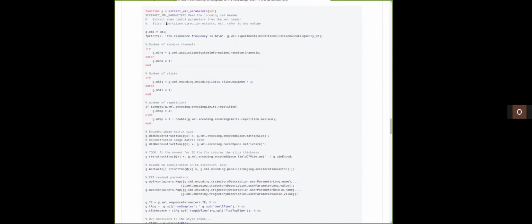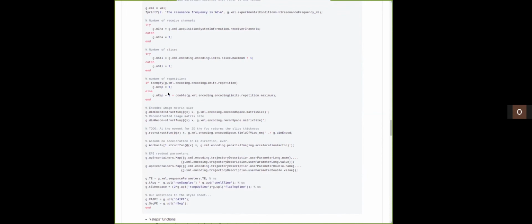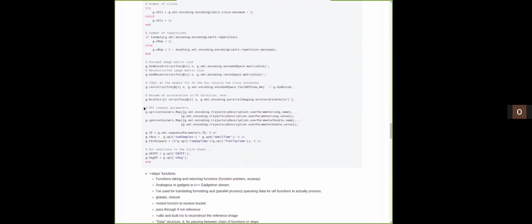So it certainly proves useful, as I was laboring on about having a global structure. And we start this off by sticking the whole of connection header in there. We then parse the XML a little bit. I'm particularly proud of these ones here, which are MATLAB's way of finally introducing the map object, which allows us to map named objects from the style sheet, conversion from user parameters on the user card.